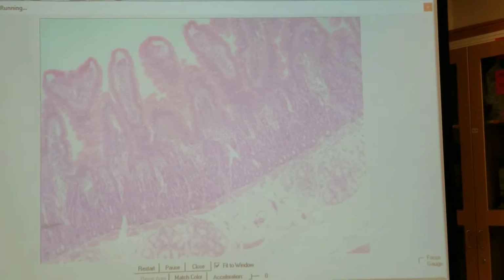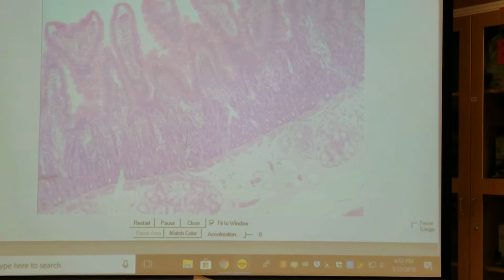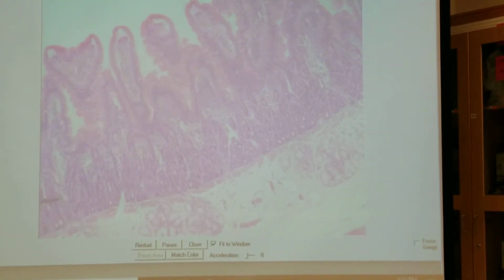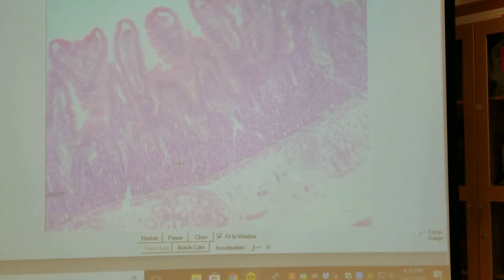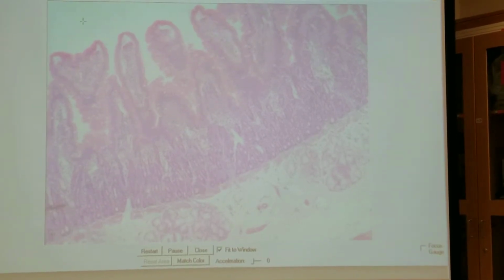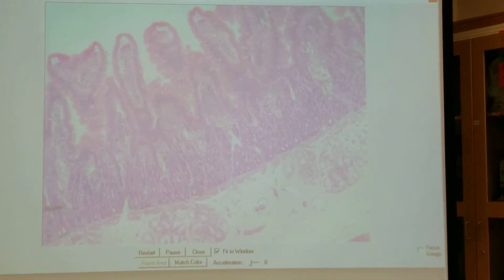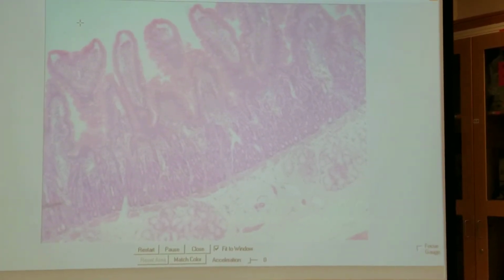And then we've got these small holes down here. So we've got this whole layer at the base, where we've got all these little holes next to each other. What are these? Intestinal crypts. Those are your intestinal crypts. They're going to be smaller than the villi. What's this space called up here? Lumen. That's your lumen. And what kind of tissue are we going to find? Actually, we put a pin in that question and come back to it when we go a little bit closer.